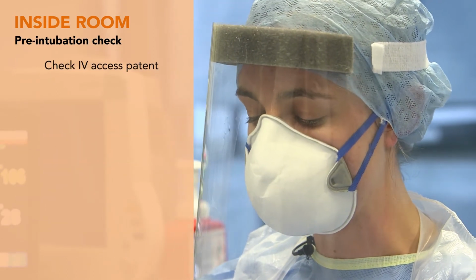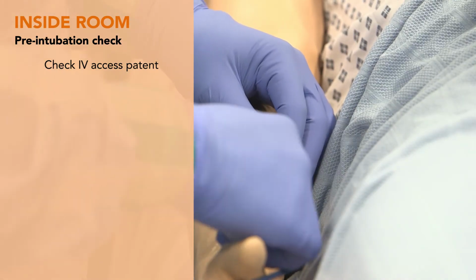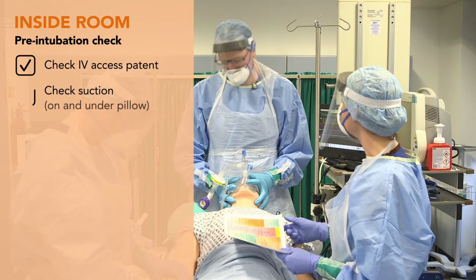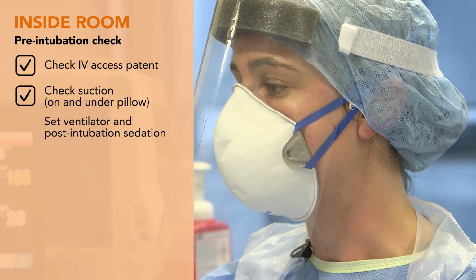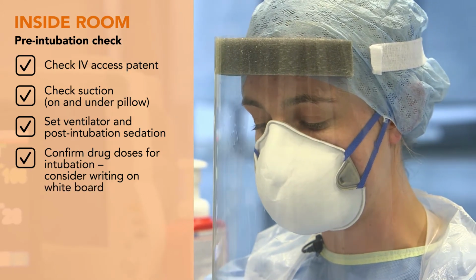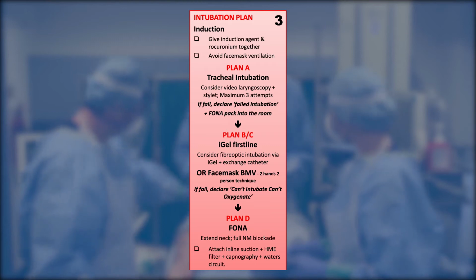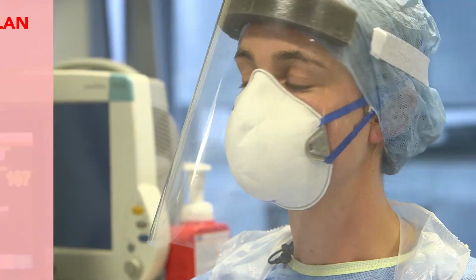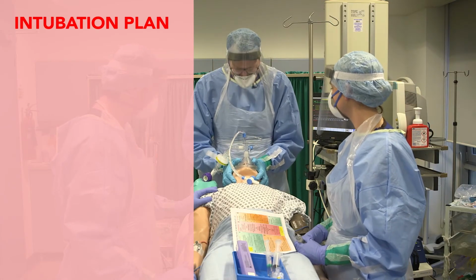So Trev, are you happy the IV access is working? And that's working well. Ben, is your suction on and under the pillow? Yes. Trevor, you happy with ventilator settings and our sedation for post-intubation? Yeah, they're all set up. And we've already confirmed our drug doses and we've written them on the whiteboard. Okay, so we've adequately pre-oxygenated. So we're just going to drift you off to sleep now, okay?